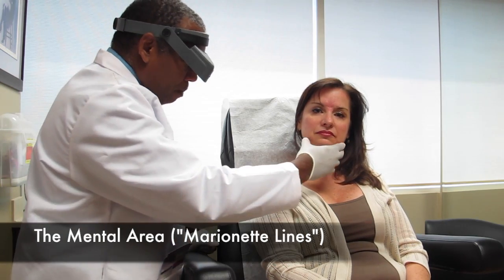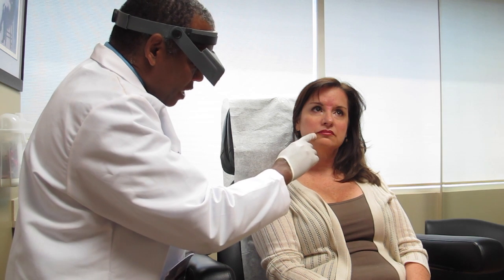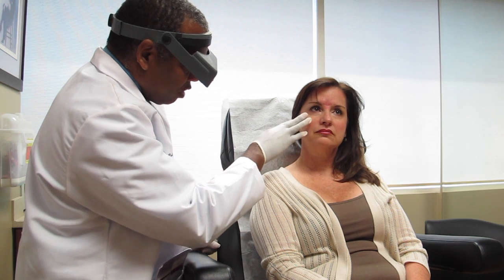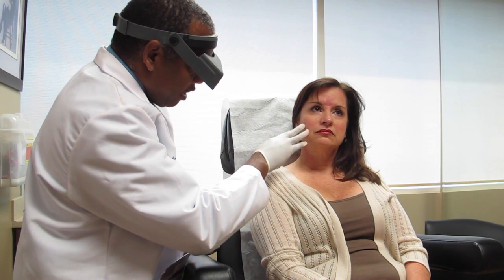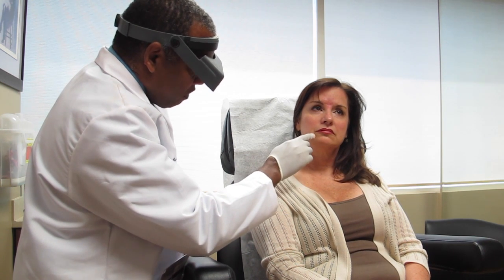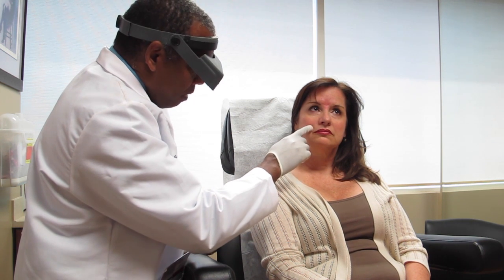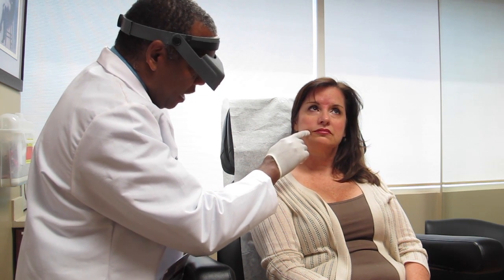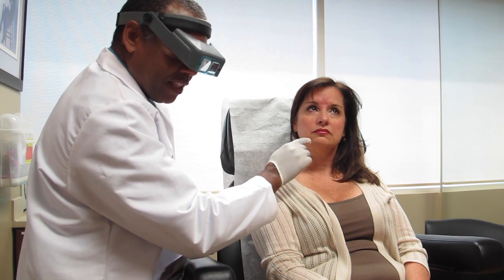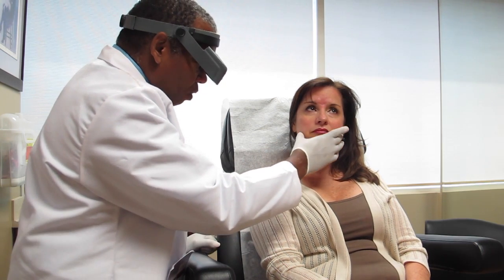Now what we're doing is injecting a little Botox into the mental area. Sometimes we get these marionette lines here, and they really come from the fact that we lose volume — everything kind of drops down. There are a couple of ways to address this; obviously with filler you can lift it, but when it's very mild like this I usually inject a little Botox. There are muscles that pull it down and muscles that lift it up — we're weakening the ones that pull it down to get some lift and soften the area on both sides.